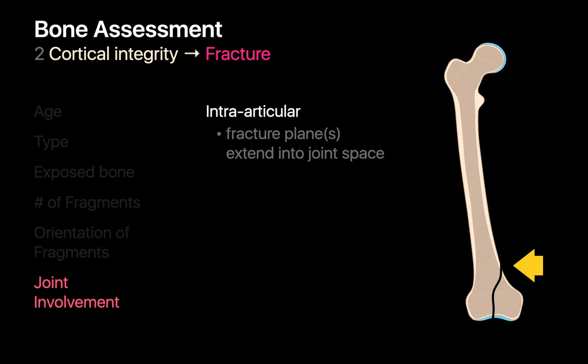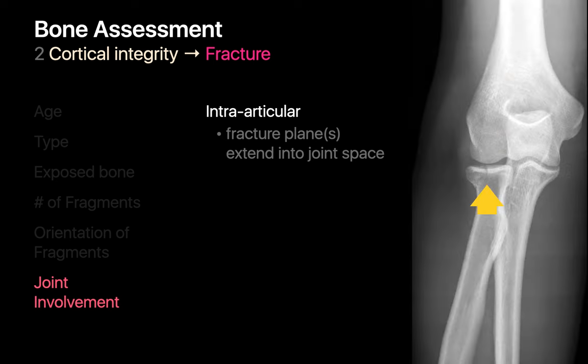Finally, describe if there is joint involvement by the fracture plane. Intraarticular fractures, like this one, extend into a joint space and may substantially affect joint function, lead to accelerated arthritis, and often may require open reduction and internal fixation.